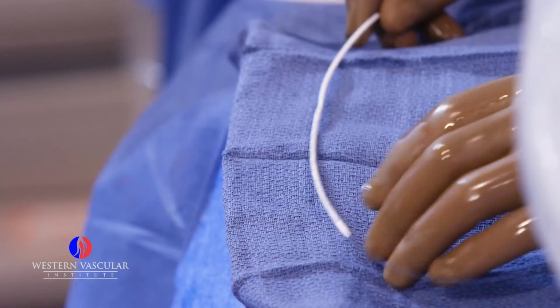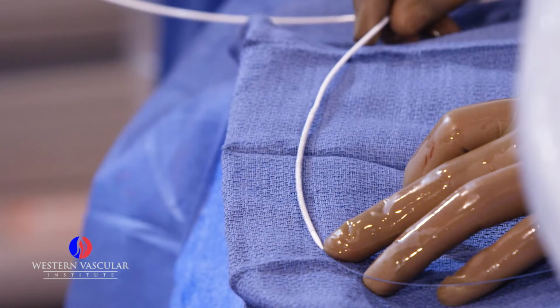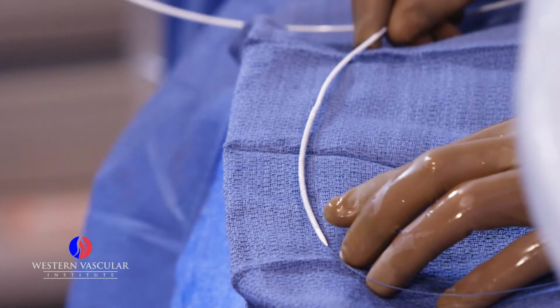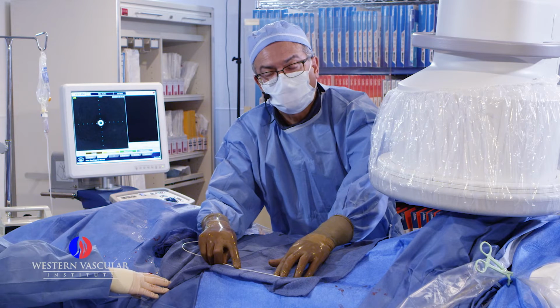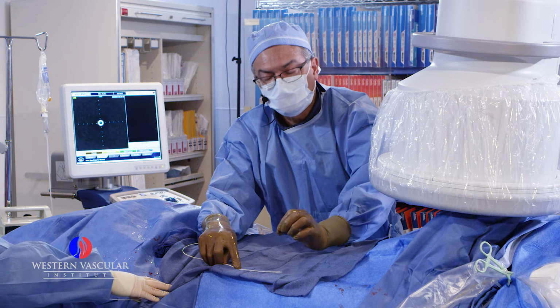You can see this is a cover stent. It's called Viabahn from the Gore company. You can see the stent goes from this point here to this one. It's 10 centimeters long, and based on our measurements, should be enough to cover the length of the stent. It's crimped into the device.